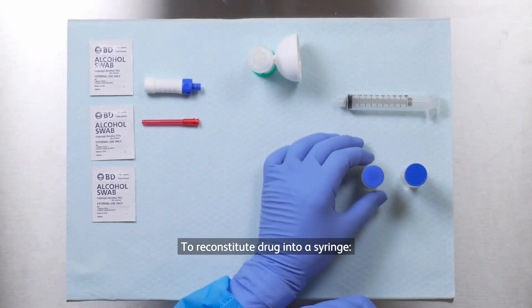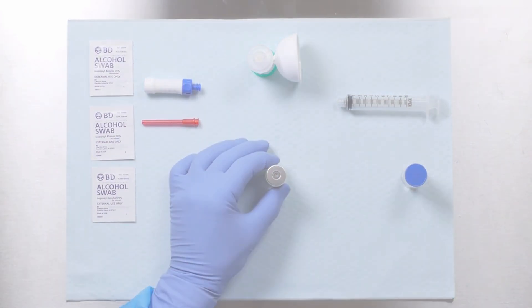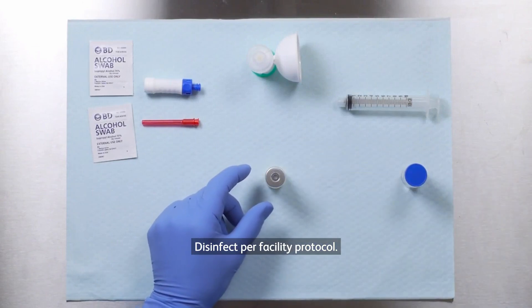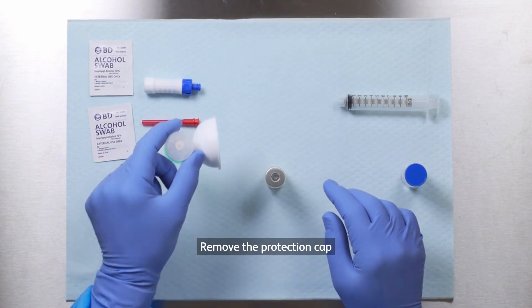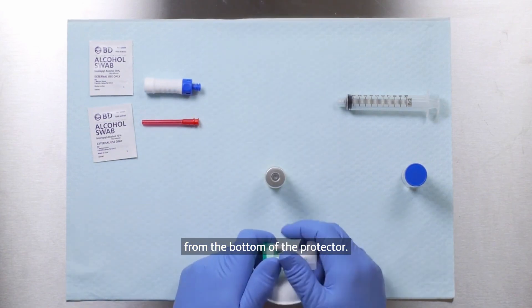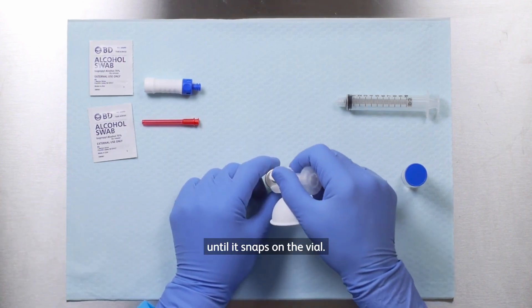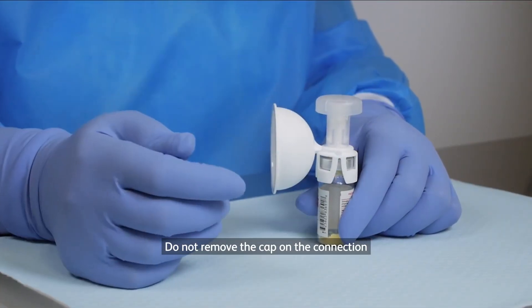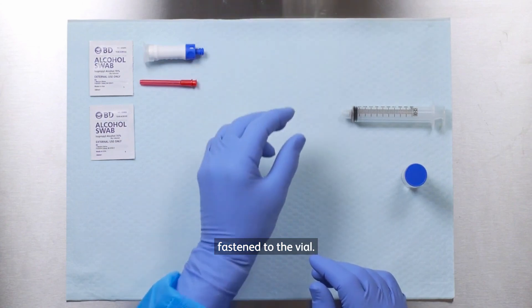To reconstitute drug into a syringe. Disinfect per facility protocol. Remove the protection cap from the bottom of the protector. Attach the protector until it snaps on the vial. Do not remove the cap on the connection interface until the protector is securely fastened to the vial.